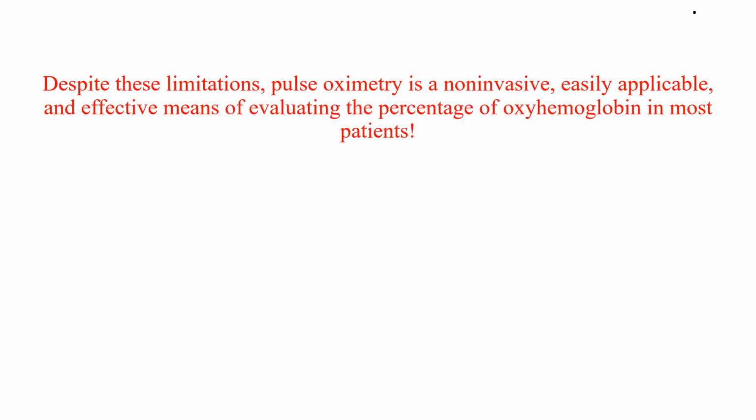Despite these limitations, pulse oximetry is a non-invasive, easily applicable, and effective means of evaluating the percentage of oxyhemoglobin in most patients.